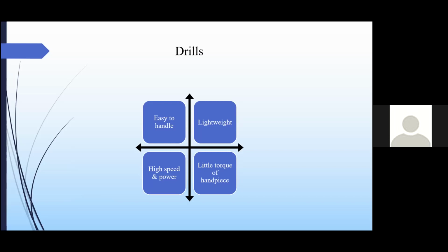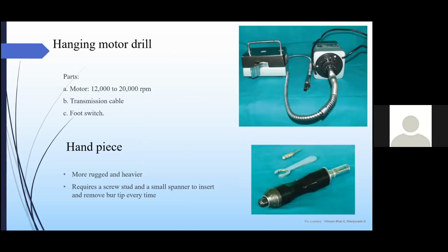And the power or the speed of the drill is also a very important factor, because a high speed drill will provide efficient bone removal, and it will provide a wider and complete drilling of the bone, and thus the penetration is less and the complications are less, which is not seen in the case of a drill with a lower speed. So lower speed drills can also be used, but for delicate structures. But for efficient bony removal, we should use a high power drill.